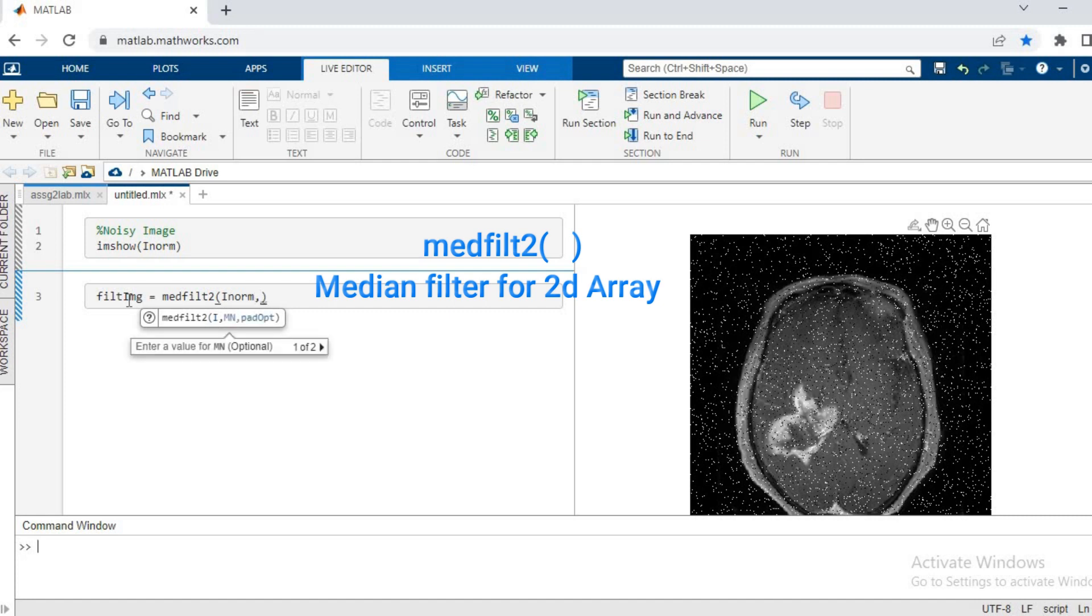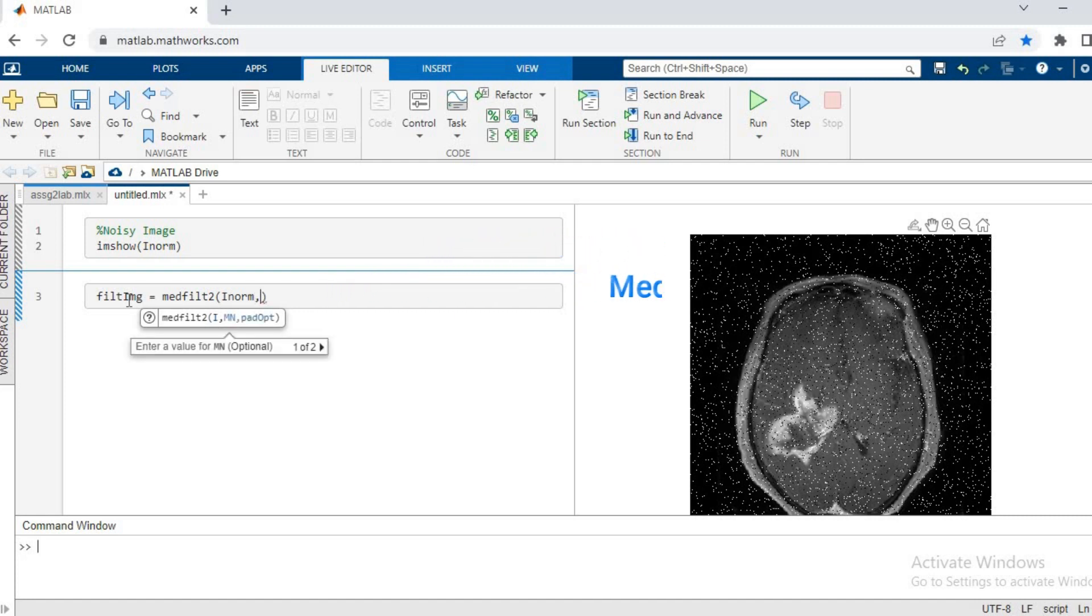Then we pass 3 by 3, that is our window size. So for starters, we'll start with a size of 3 by 3.